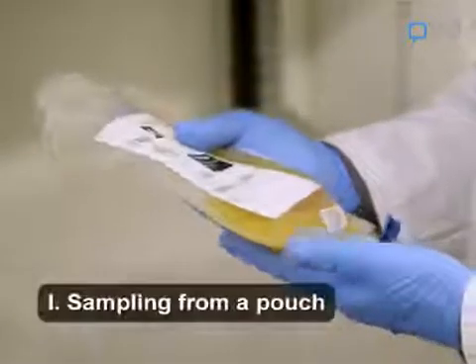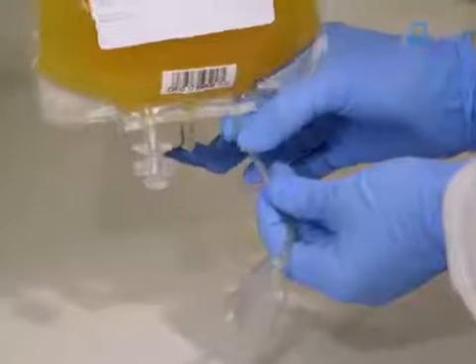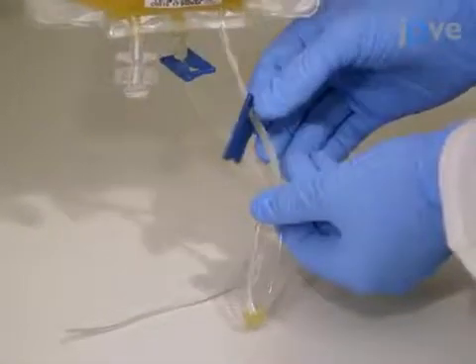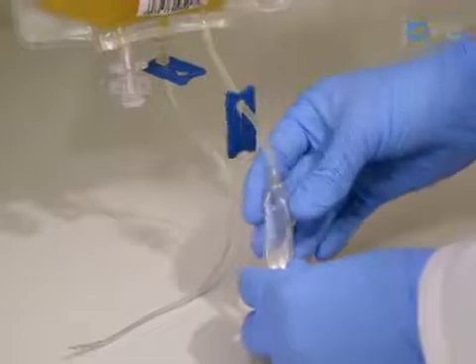There are three methods to obtain a sample from a platelet concentrate. To sample from a pouch, mix the content of the platelet bag well by gentle horizontal movement for five seconds, tipping from end to end five times. Open the clamp to the pouch — it is evacuated and will fill by itself. It is not necessary to fill the pouch completely, as only a 100 microliter sample will be required for dynamic light scattering, or DLS, testing.